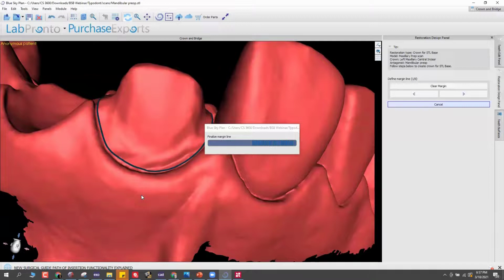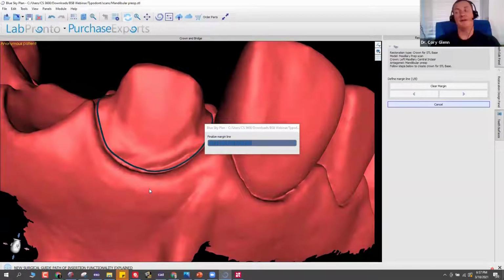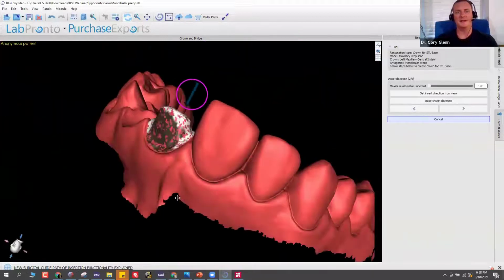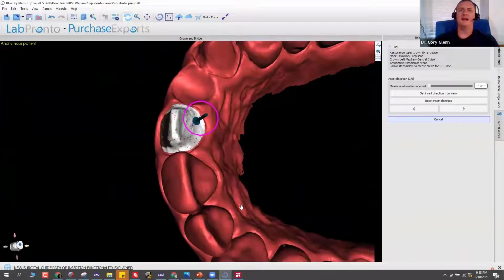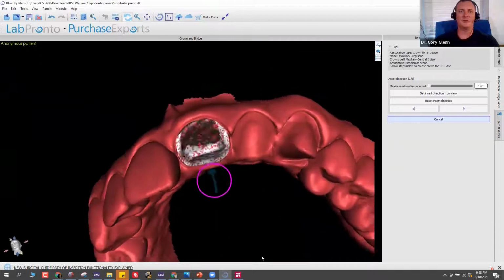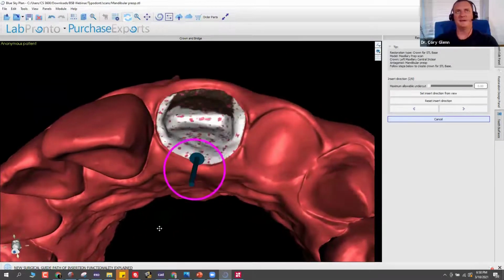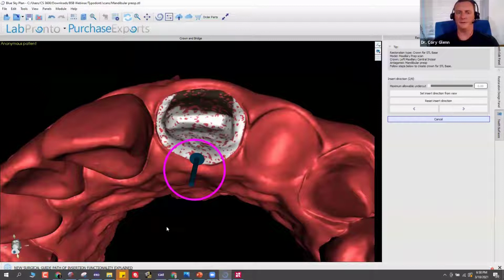Can you print multiple crowns at a time? Yeah, in fact, that's one of its huge advantages over milling. Think back to one of my early slides where I was doing those no prep veneers. You could print, let's say, 24 veneers or crowns or whatever all at once in one build, and it would be 23 minutes.